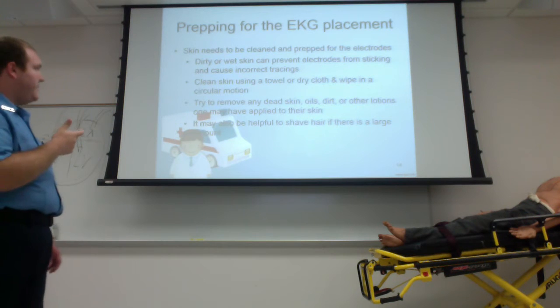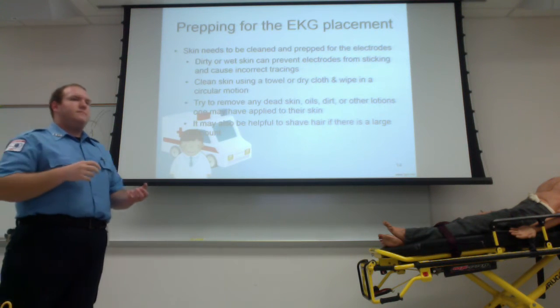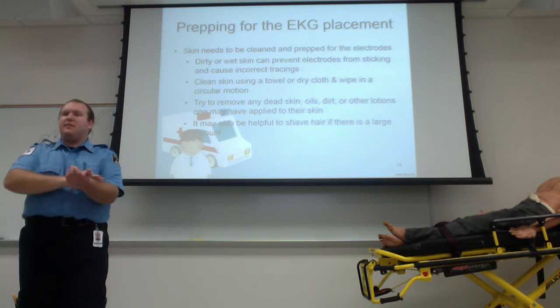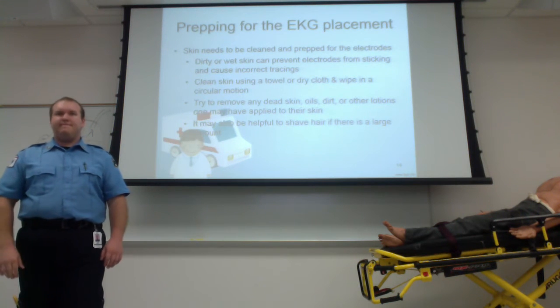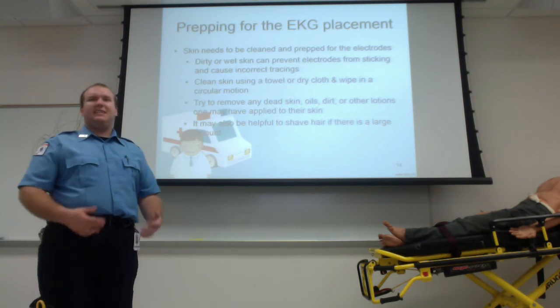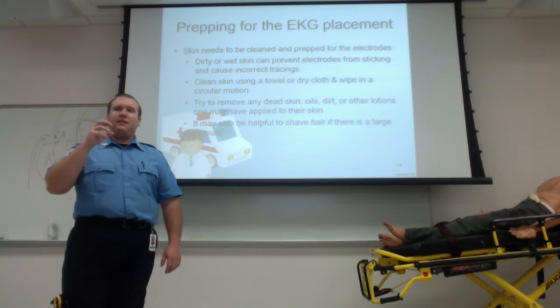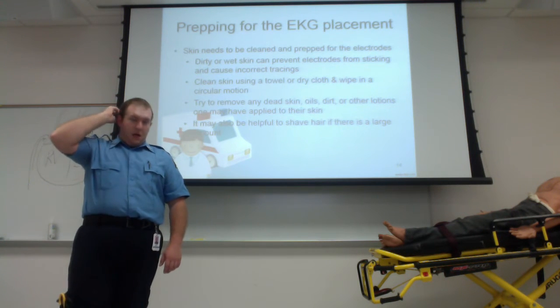So like I said, the first step here, clean that skin using a dry cloth, something to just clean it out, get the dirt and grime out of the way. If someone's put on lotions, for example, you want to try to get those off. Get that skin as clean as possible, so that way you can get the best sticking and the best reading from that.